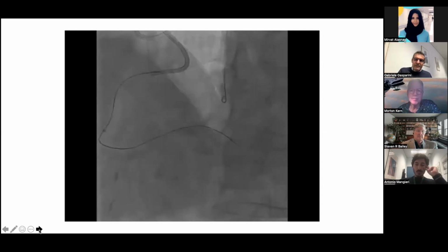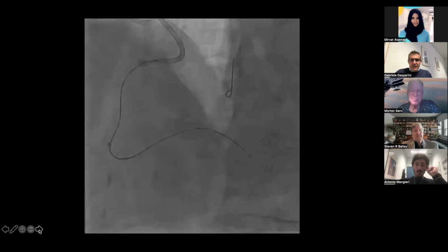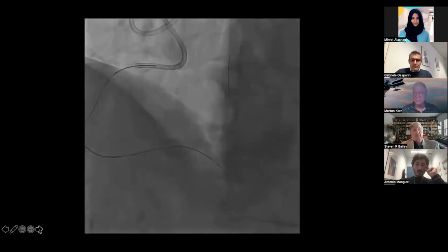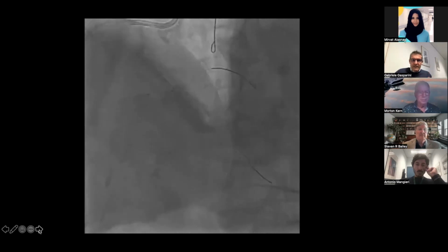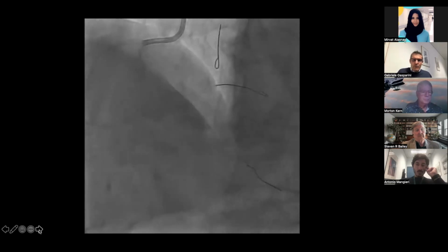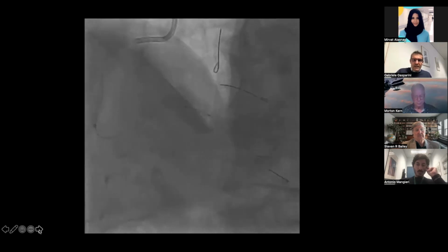And we have a picture and the video of the cutting in this technique. We advanced the balloon. We have another video, the next one. We inflated the balloon. You can appreciate how big the hematoma was here. We have another video, this one. Look, the balloon, this is a cutting balloon. We inflated the balloon at 6 atmospheres, and then we advanced the balloon, and we used the cutting balloon into the PDA, and then also into the posterolateral branch. We did exactly the same.